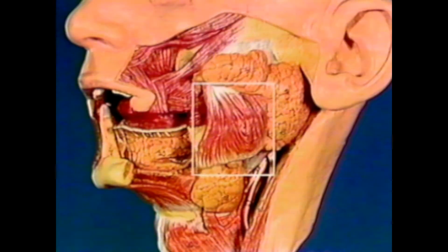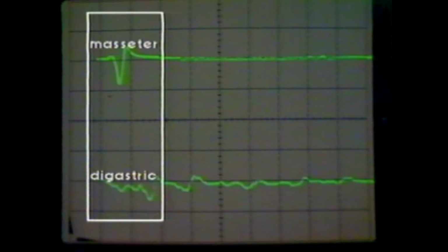Muscle spindles in the masseter muscles are lengthened and stretched. Neurons of these sensory receptors will synapse with and recruit motor neurons in the motor nucleus of the trigeminal nerve. A synchronous recruitment of several motor units is demonstrated by the amplitude of the biphasic wave seen after the stimulus.